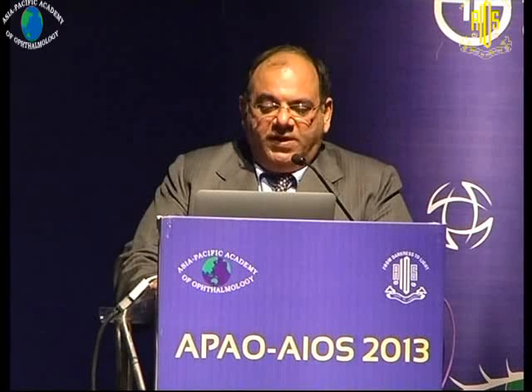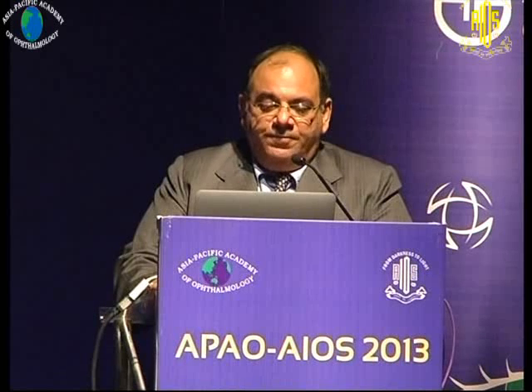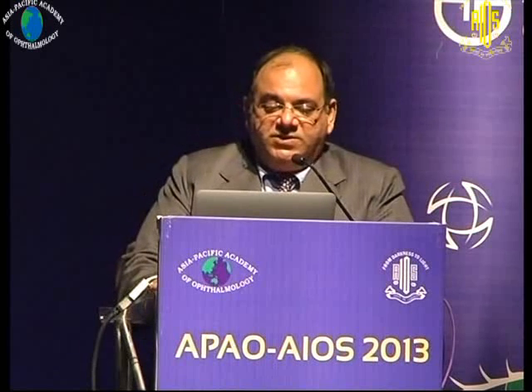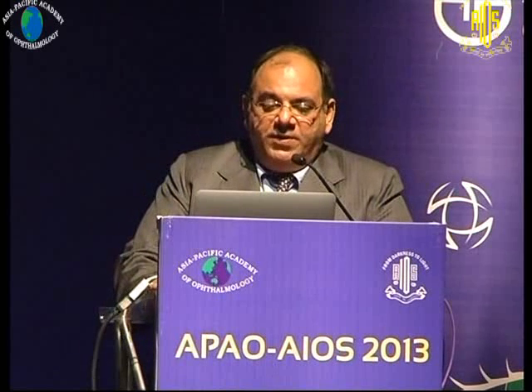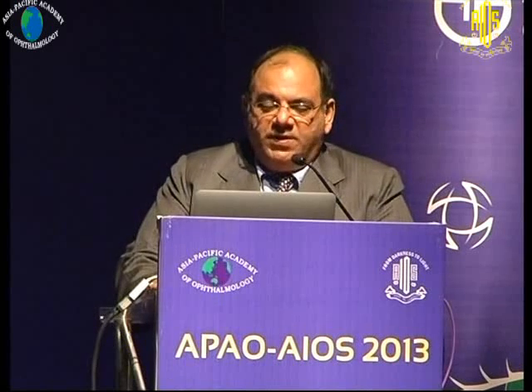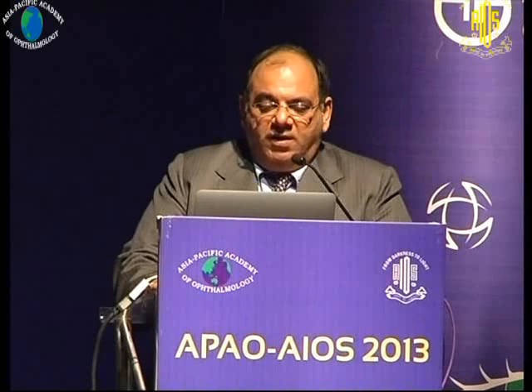all the diabetic complications which we encounter, including vitreous lavage and silicone oil removals, which may be needed in these eyes. Besides ocular trauma cases, retinal detachment repair when cataract coexists, or to achieve a better excision in certain situations, epiretinal membrane surgery and macular hole. The absence of glow and presence of vitreous hemorrhage is overcome by simple capsular staining, and a corneal-friendly surgery with adjuvants is done to protect the cornea.